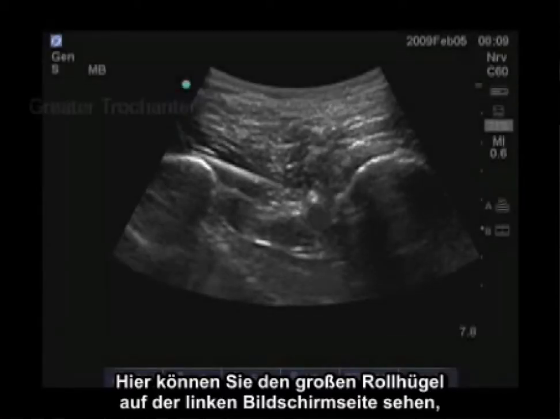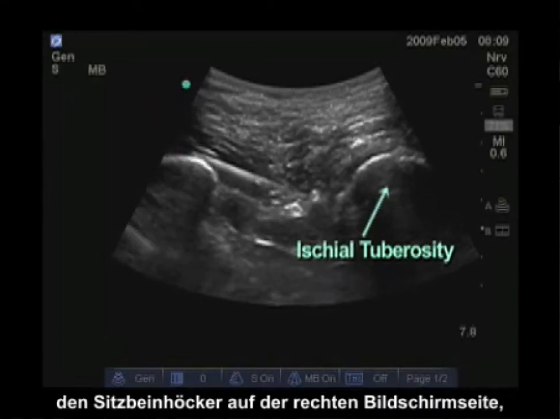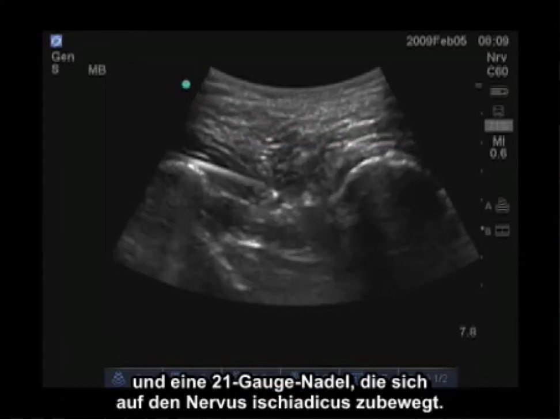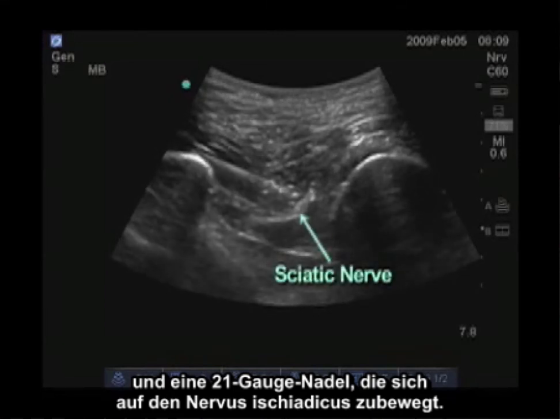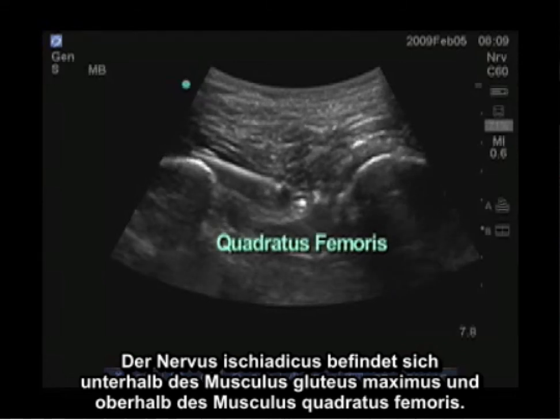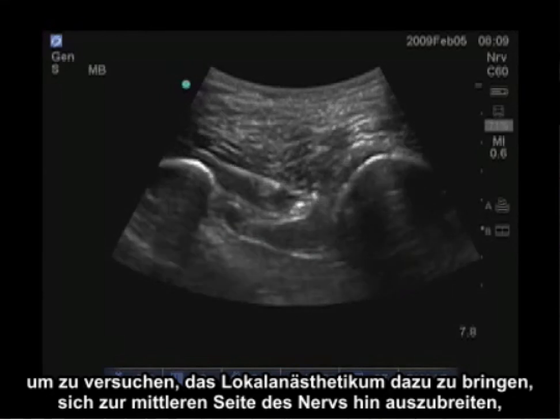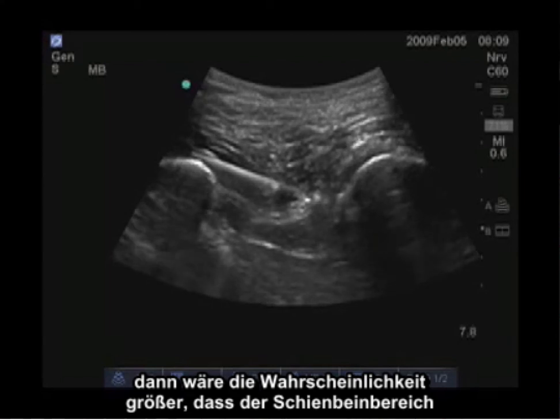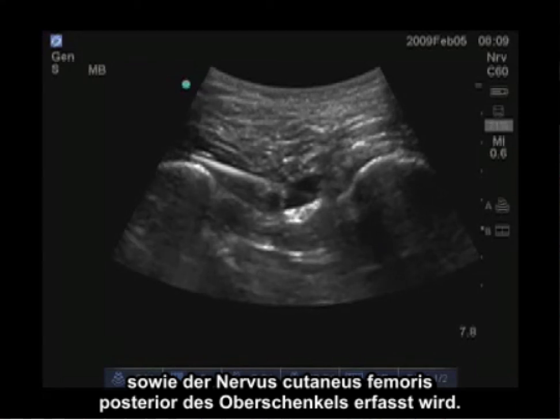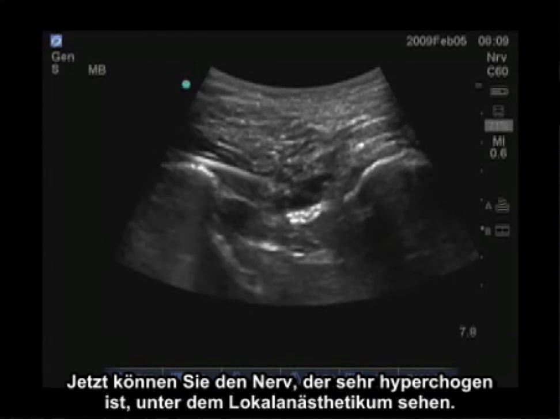Here you can see the greater trochanter on the left side of the screen, the ischial tuberosity on the right side of the screen, and the gluteus maximus superficially. A 21-gauge needle is advancing to the sciatic nerve, which is below the gluteus maximus and above the quadratus femoris. The needle advances above the sciatic nerve to get local anesthetic to spread to the medial side of the nerve, which more reliably covers the larger tibial component as well as the posterior femoral cutaneous nerve of the thigh. Now you can see the hyperechoic nerve below the local anesthetic.